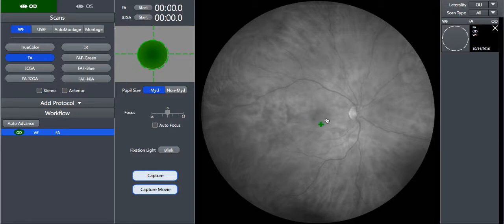Now, because this is an image type that requires a timestamp, these timers appeared when I selected FA. The timers are not visible when other untimed scan types are selected. So I'm going to start the timer, then I'm going to come down here to capture the first image. And we can see over here is the thumbnail of the image I just captured.